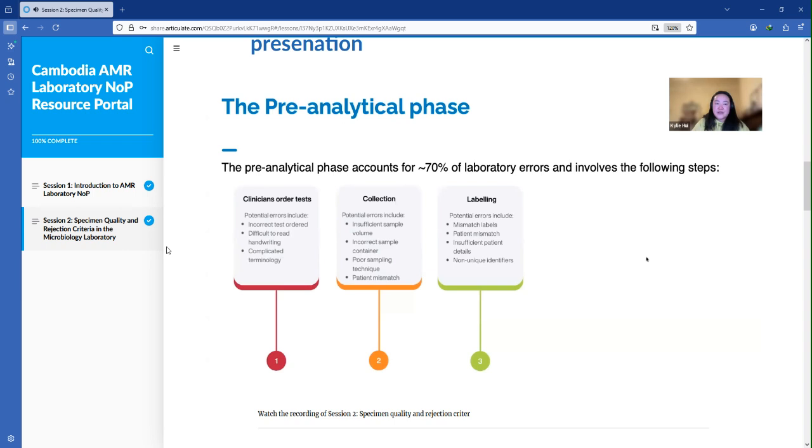Depending on the patient and the type of blood cultures you're collecting, for adult bottles, your anaerobic and aerobic bottles should have around 10 mils. For pediatric bottles, it is anywhere between 1 mil and 5 mils. And it's really important here to follow the manufacturer guidelines.